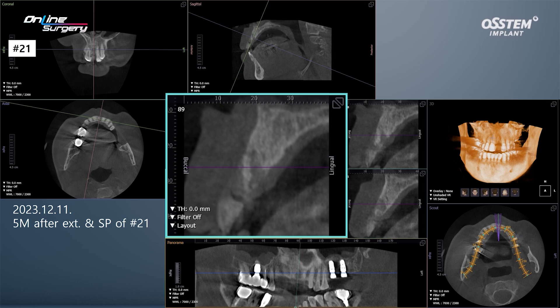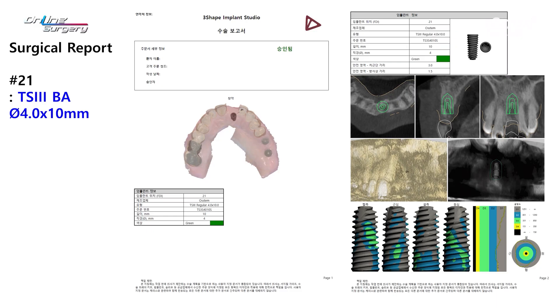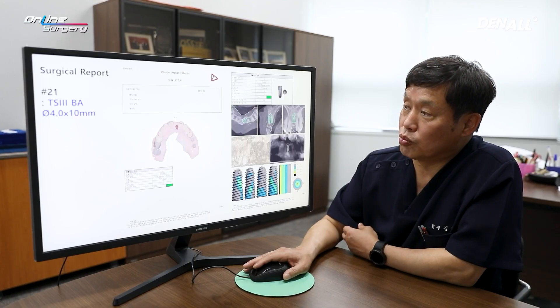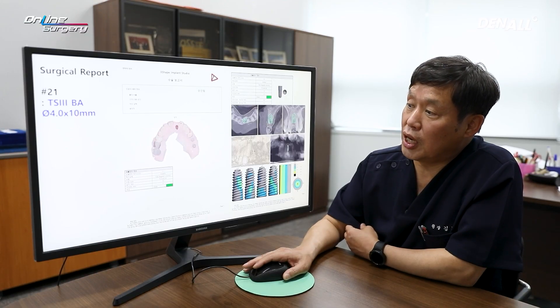Working with the OneGuide team, we developed a surgical plan. The implant will be positioned palatally, and since the site underwent socket preservation, additional bone grafting will be performed in the labial area.